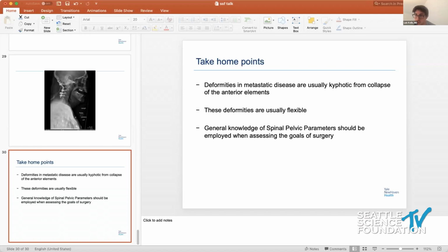All the armamentarium that you mentioned is extremely useful. I think pedicle screws have become the mainstay for a lot of these because of the ability to cement, augment, and fenestrate to make sure that they don't fail with time, especially in this particular population. But having the ability to have your hooks, either laminar hooks or TP hooks or pedicle hooks available, or wiring translaminar, especially where destruction from metastatic disease has taken place, is extremely useful.